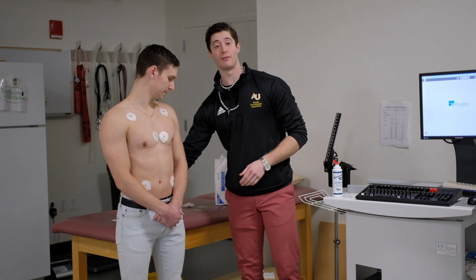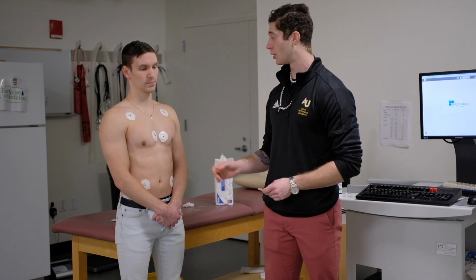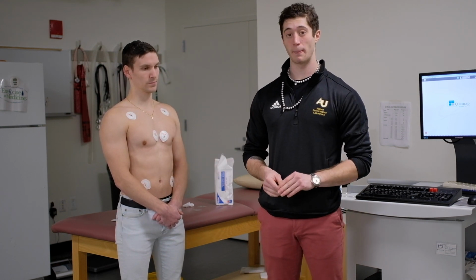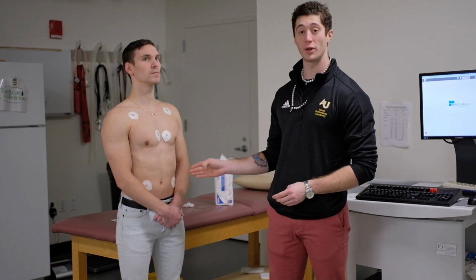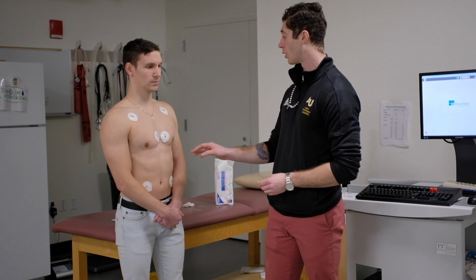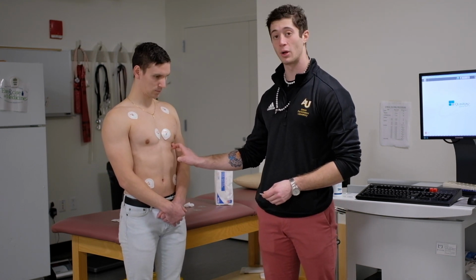The next leads are V4 and V3. The reason I say V4 first is because you're going to be placing V4 first. V4 goes directly on the mid-clavicular line, so directly in line with the nipple on many people, in the fifth intercostal space. So you're going to find the space slightly below the nipple. That's the fifth intercostal space.